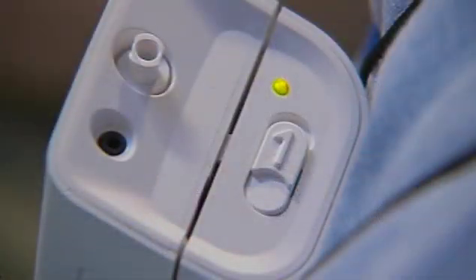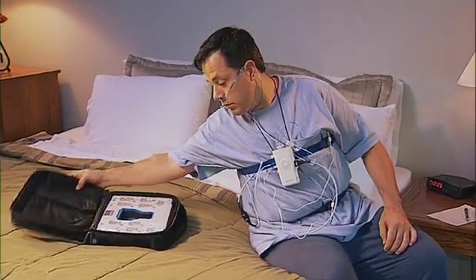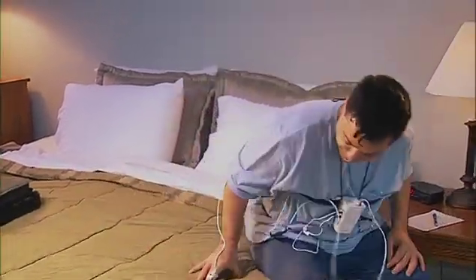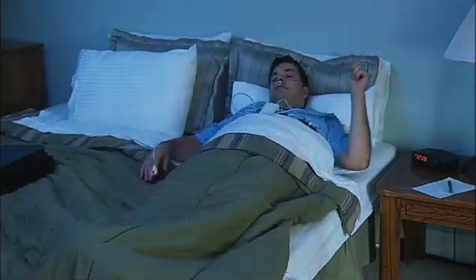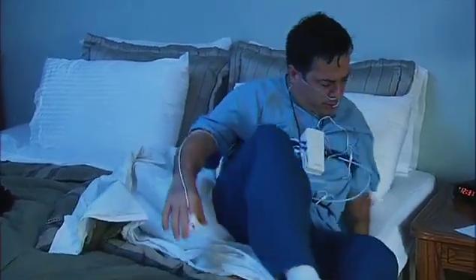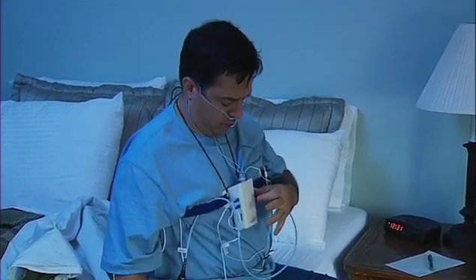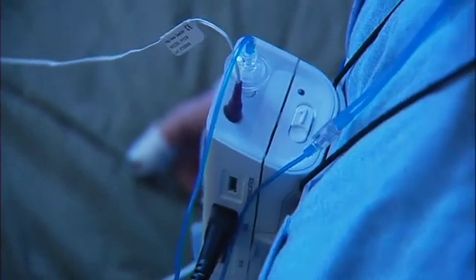Insert the yellow connector into the yellow color-coded port on the side of the PDX device — the device is now assembled. The light on the top of the device will turn from yellow to green to indicate the sensors are correctly attached, then the green light will turn off. Before lying down for sleep, press the button on the front once. You may now go to sleep. If you get up for any reason during the night, press the same button again once.